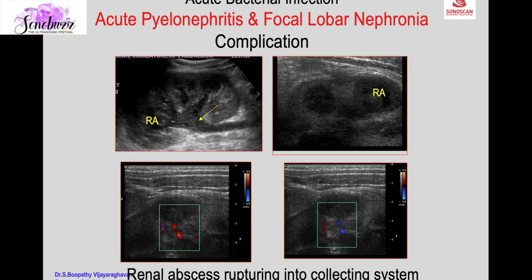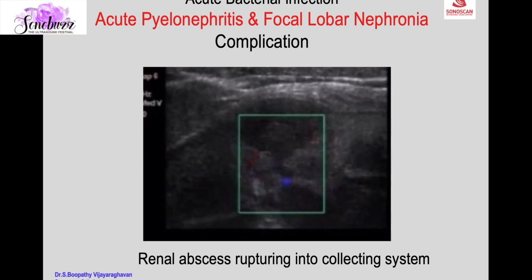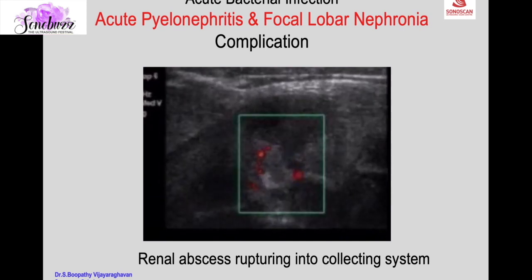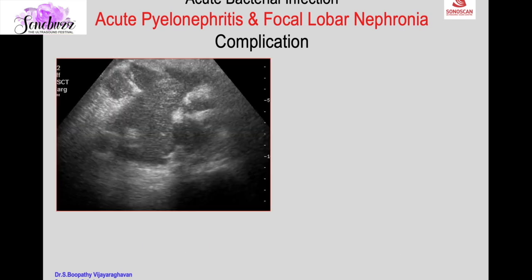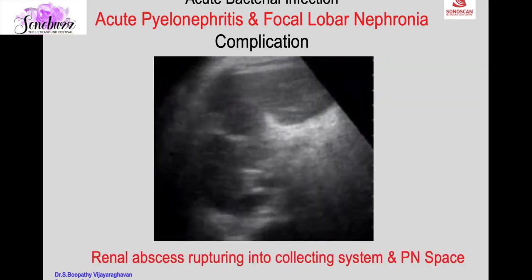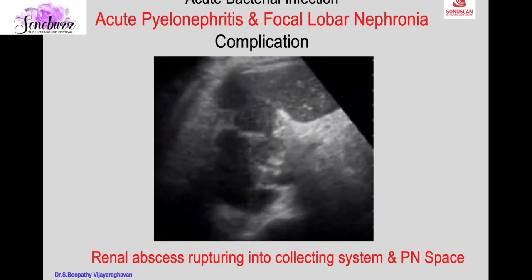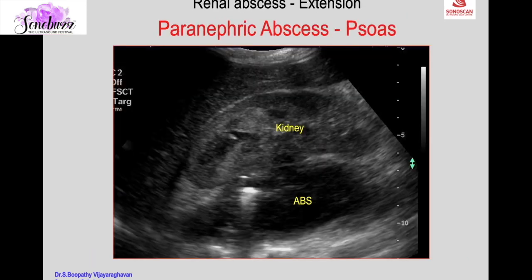The communication between the renal abscess and the calyx can be demonstrated with color Doppler using a press-release movement showing alternating red and blue. The abscess can rupture both into the collecting system and the perinephric space, with real-time showing movement of debris from the perinephric space into the collecting system and the abscess. It can extend further outside the kidney as a perinephric abscess extending into the psoas muscle.